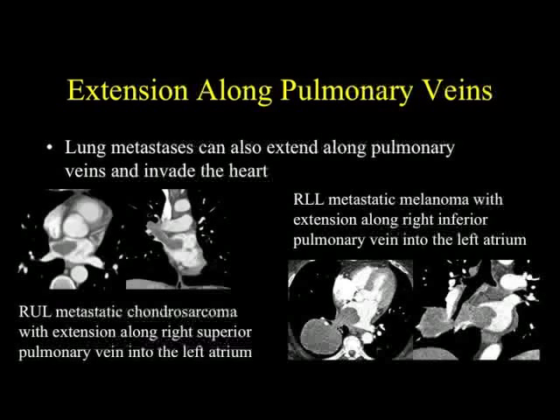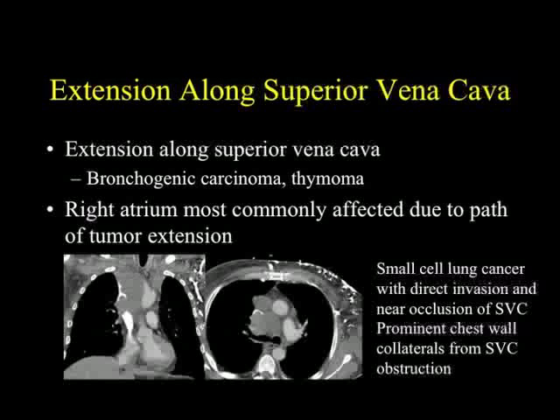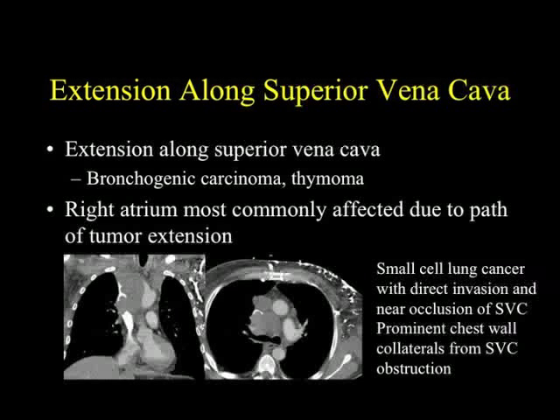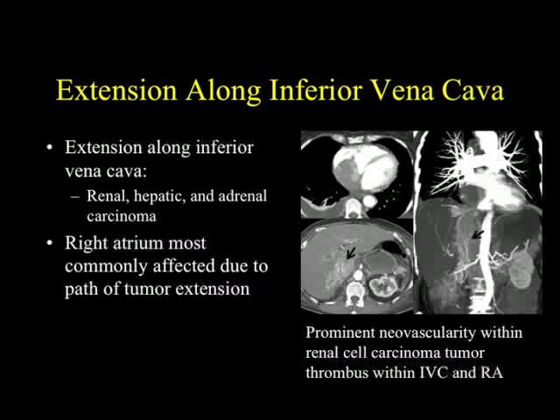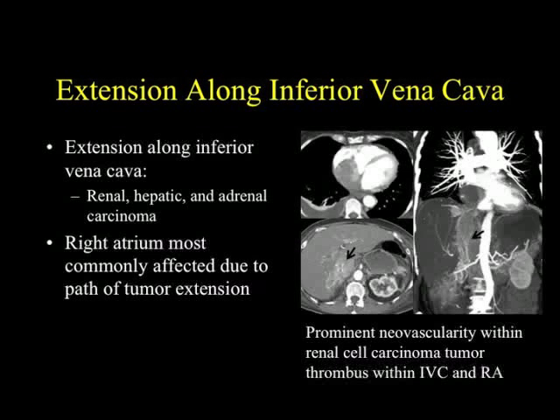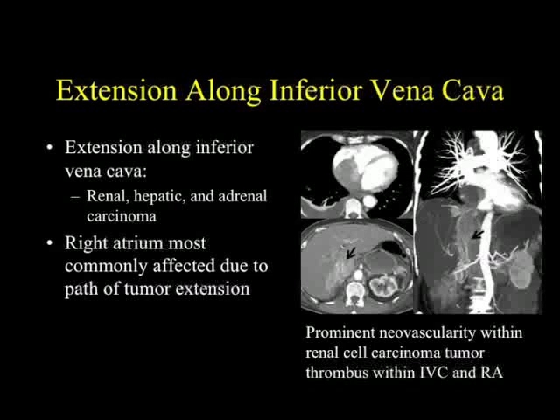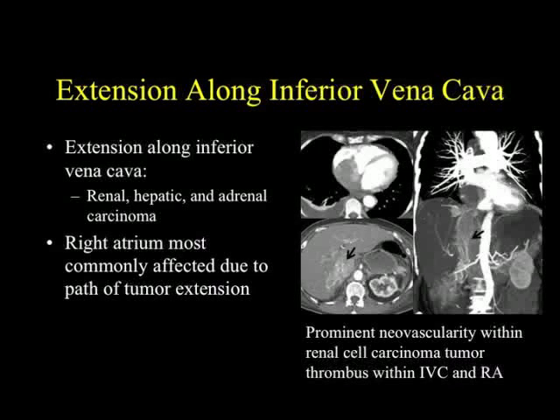We can also see extension along the SVC — we think about lung cancer and thymoma in that scenario, and of course the right atrium is most commonly affected. Here's a nice example of right atrium involvement with tumor extension. Thymoma is one of the classic things to consider. In this case of small cell carcinoma, we look for SVC obstruction, which this patient has — you can see the collaterals in the chest wall. SVC obstruction and tumor extension are very nicely seen together.